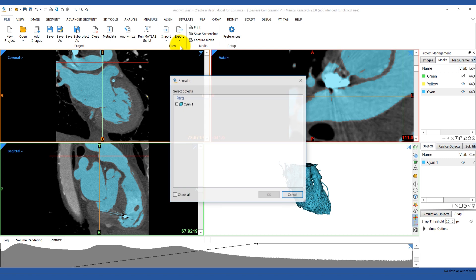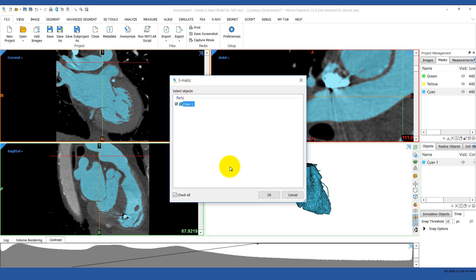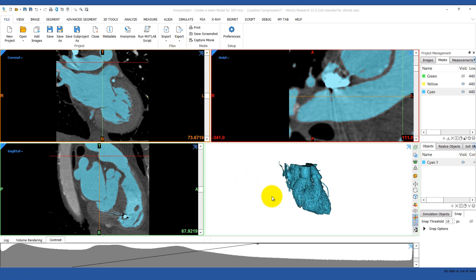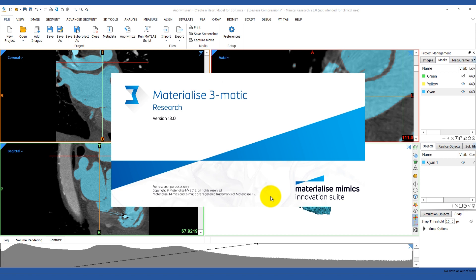3-matic is a post-processing software for STL files. We can use it to smooth, clean, or hollow out our model.